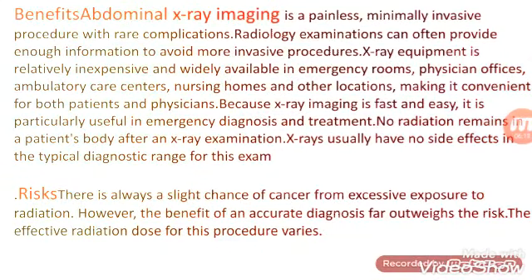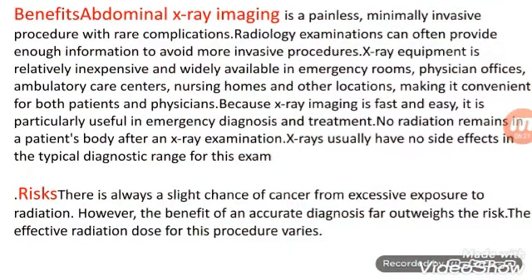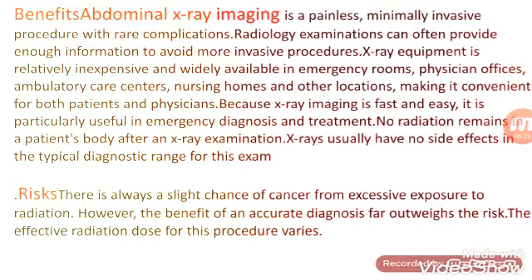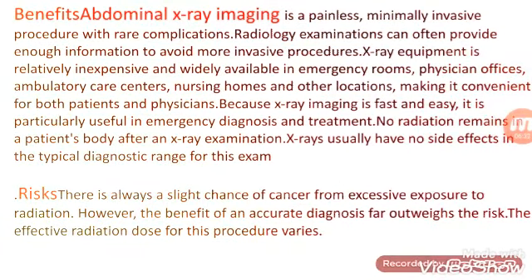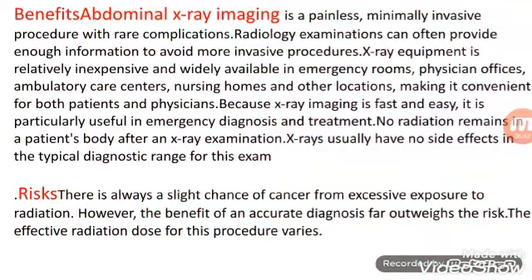The benefits and the risks of abdomen X-ray imaging. Benefits: it is a painless and minimally invasive procedure with rare complications. Radiology examination can often provide enough information to avoid more invasive procedures. X-ray equipment is inexpensive and widely available in emergency rooms, making it convenient for both patients and physicians because X-ray imaging is fast and easy. It is particularly useful in emergency diagnosis and treatment.